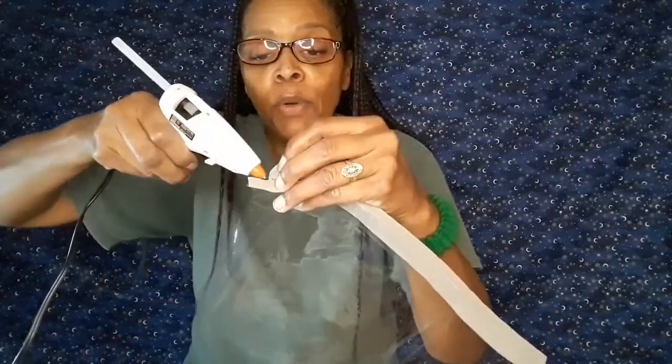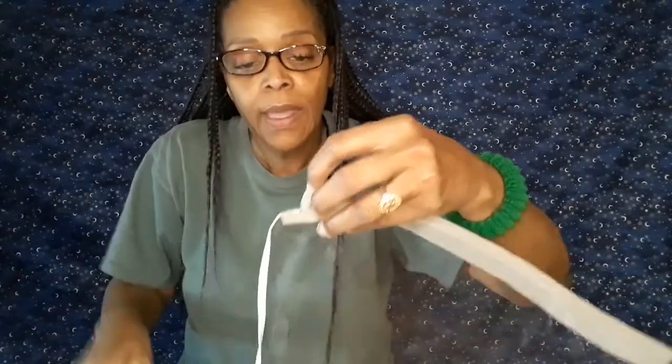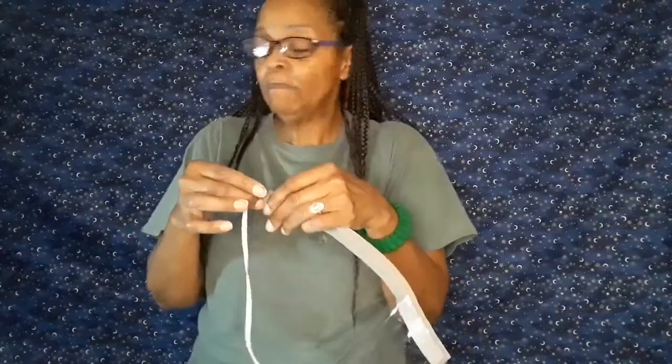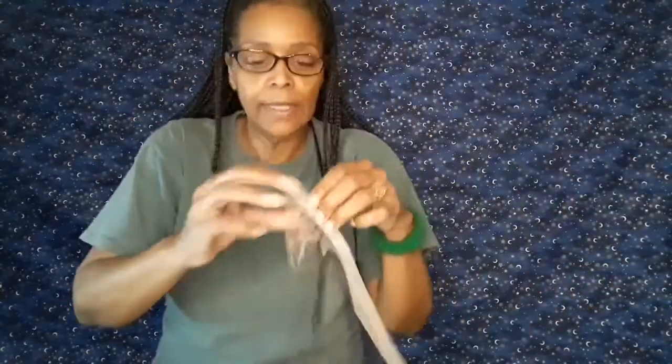But for now, I'm going to take the elastic and get ready to place it in between. But before I do that, I'm going to put a bead of glue right in between on both sides. Bead of glue. And then I mush it together. And what I tend to do is put a little binder clip, some kind of clip, to hold it for a few seconds while the glue dries. And then I go to the other side.